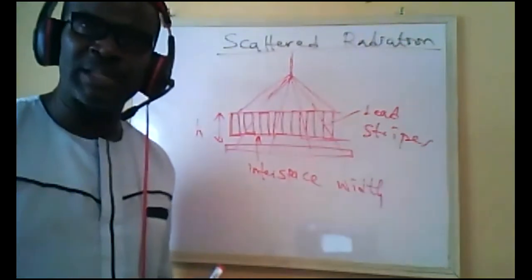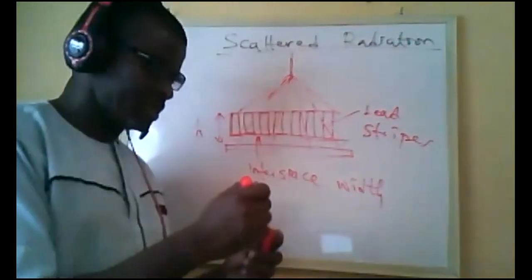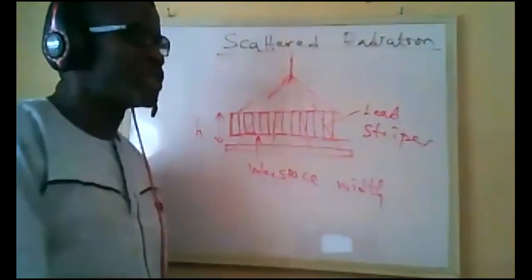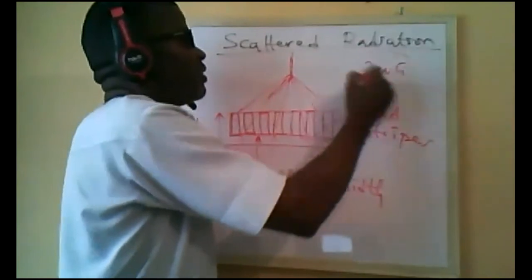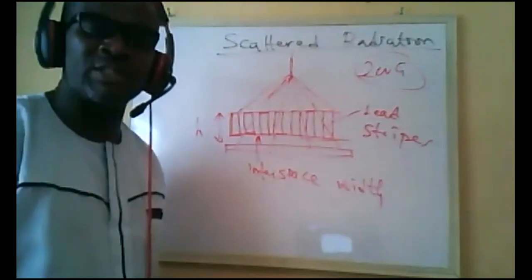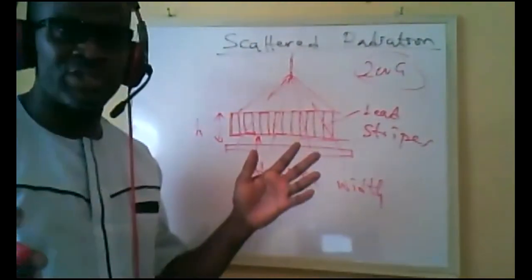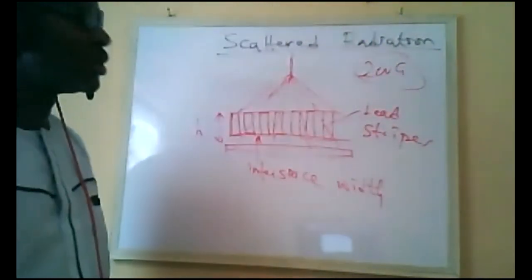Since the AEC is looking at a particular optical density, if that optical density is not reached, all it does is make more exposure. At the end of the day, because of the amount of scatter that would have been rejected, the exposure will now be increased by automatically adjusting all those values, kVp and so on, to increase the amount of exposure.